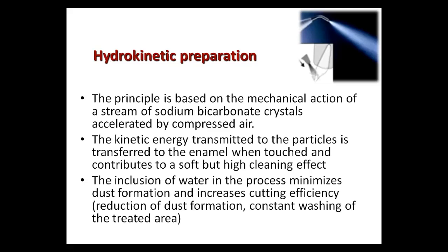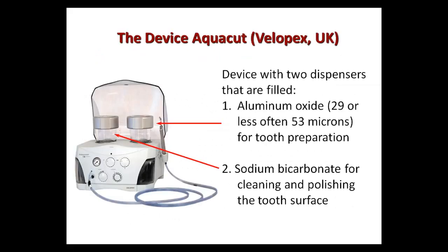The kinetic energy transmitted to the particles is transferred to the enamel when touched and contributes to a soft but high cleaning effect. The inclusion of water in the process minimizes dust formation and increases cutting efficiency. So, reduction of dust formation, constant washing of the treated area, comparing with air abrasive preparation.